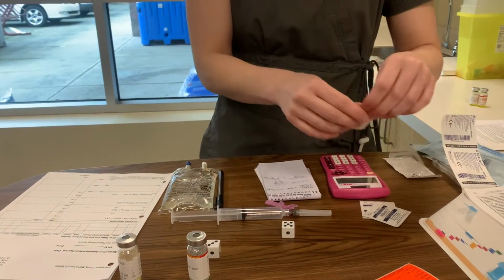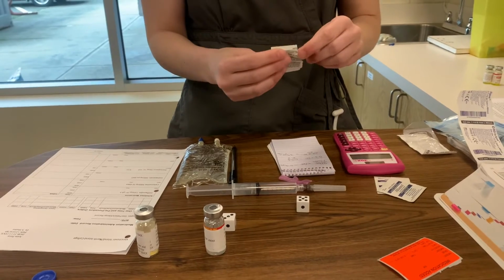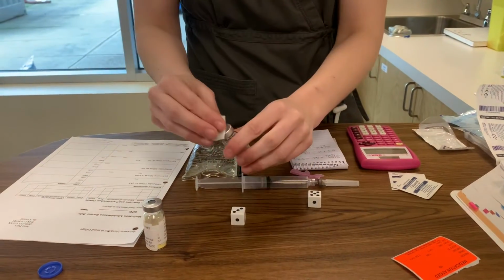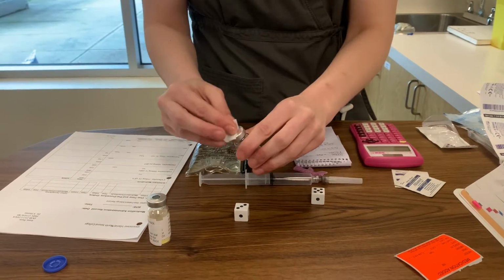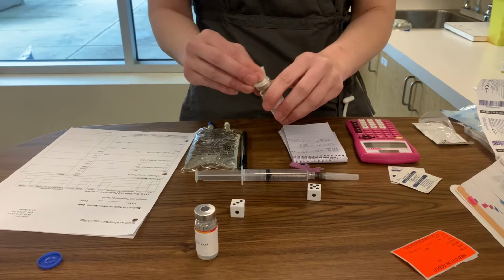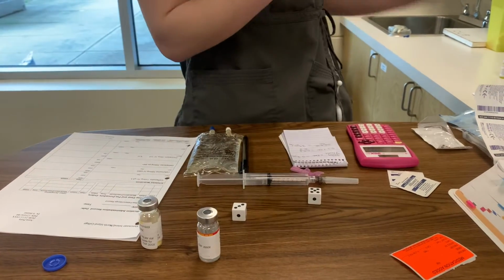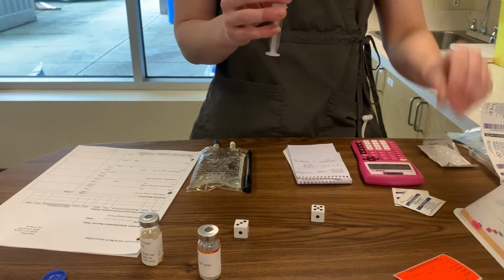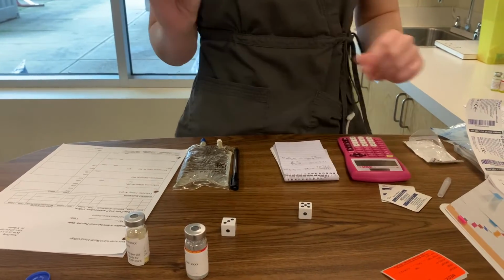I'm going to make sure I wipe my tops here and allow them to dry. Perfect. So now I can go ahead and inject 8 milliliters of air into here.